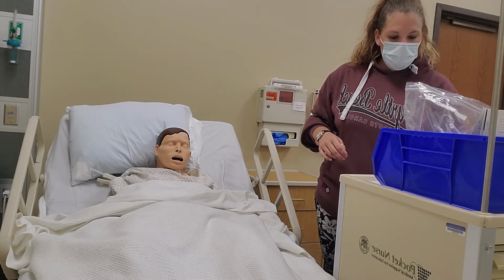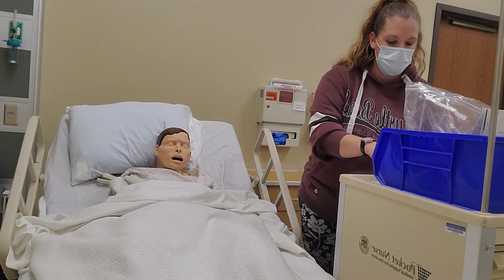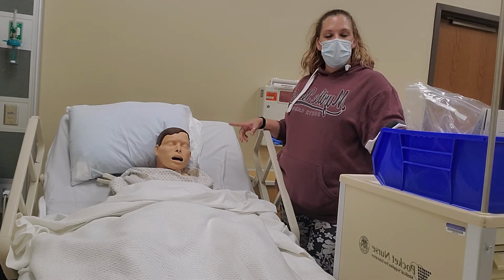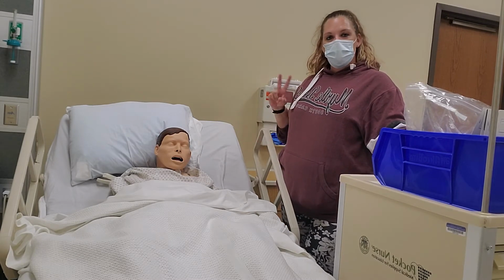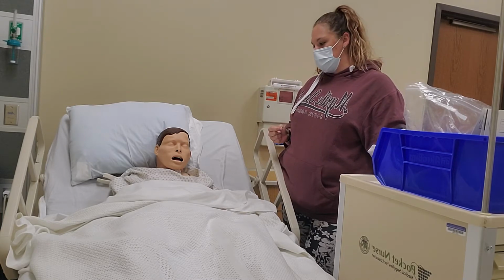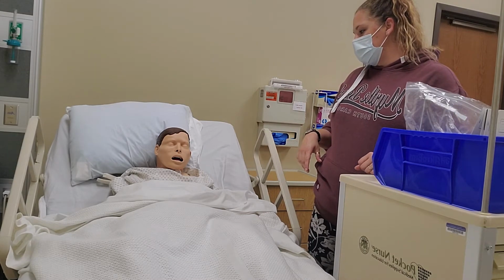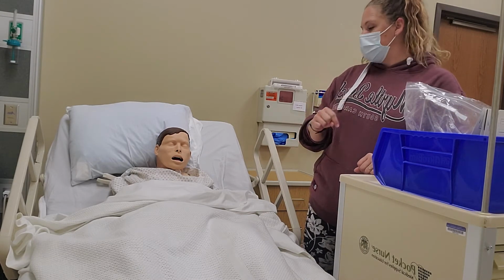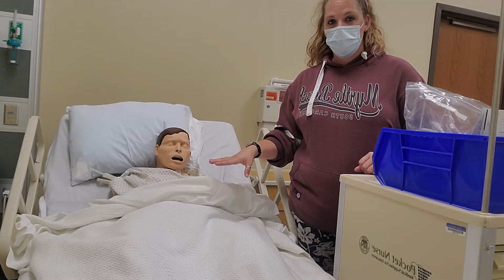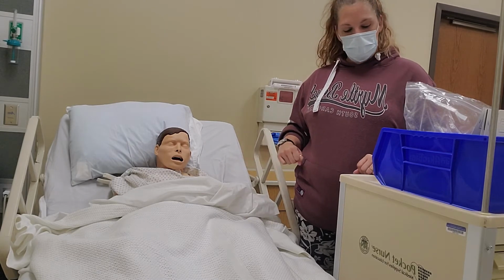I'm going to go ahead and draw up your insulin. Mr. Truman, at home, how do you do your insulin? I'm going to ask him if he draws it up in 2 separate needles or if he draws it up in 1. I'm going to draw up in 1. What was the last site that you had done? Of course, I would have already looked in my MAR. I would assess that site for any redness or a sign of infection. For this demonstration, I'm just going to give it into his abdomen.